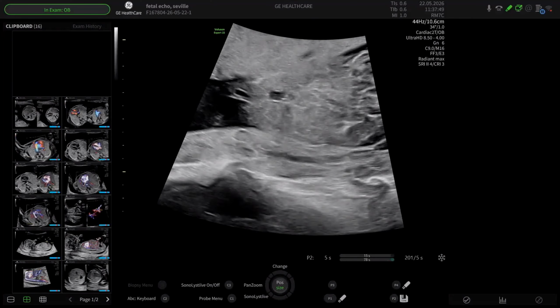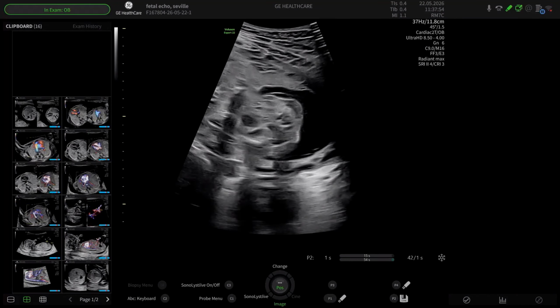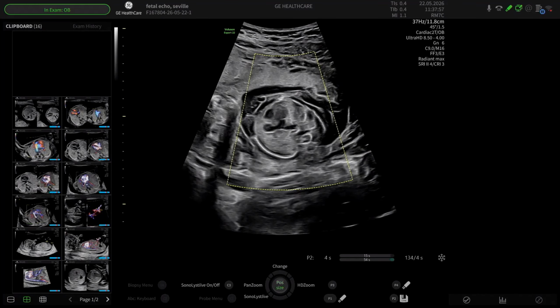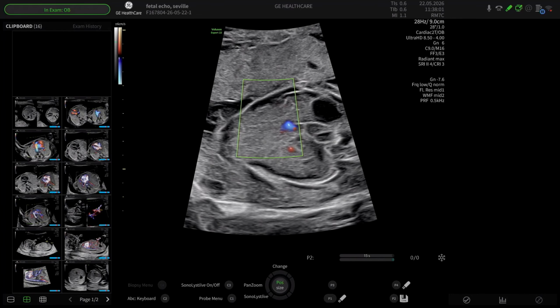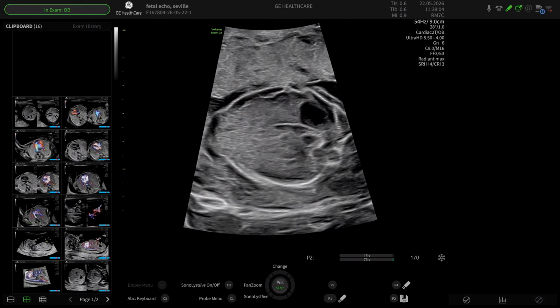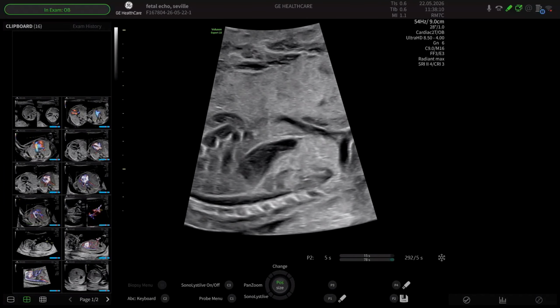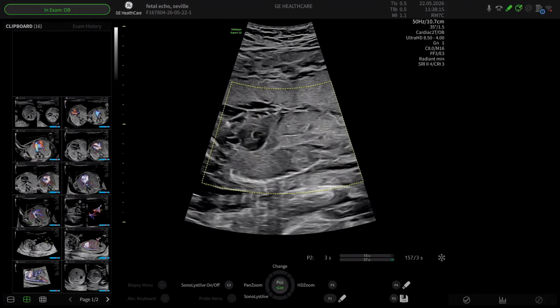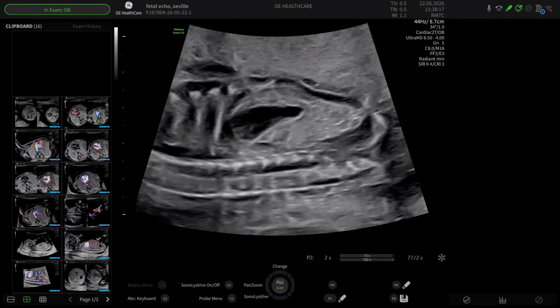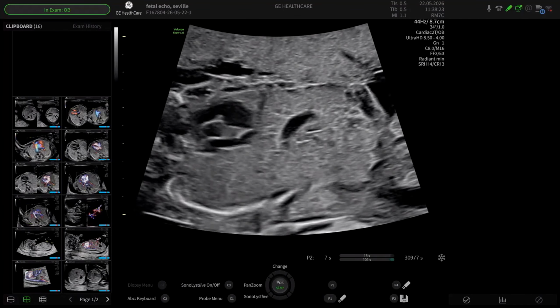Okay. Because I'll show maybe the ductus venosus, because in clinical practice, maternal-fetal medicine people will frequently, when doing ductus venosus assessment, do it on an axial section, and they'll turn on color and look for aliasing. It's not my preference. I think for every gestation, from an anatomical perspective, I'm actually just going to go back to my original preset. I think it's important to make sure that you're actually sampling the right vein, because I think frequently in clinical practice, we end up not actually sampling the ductus venosus.